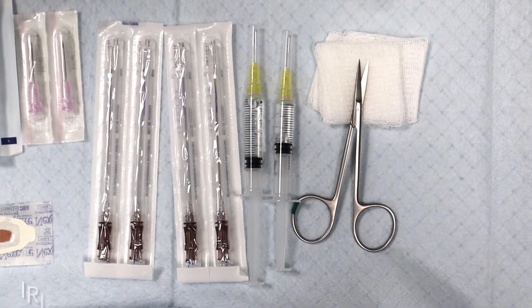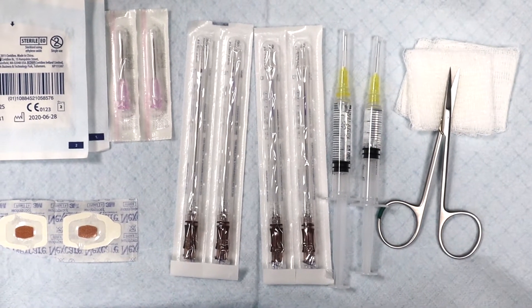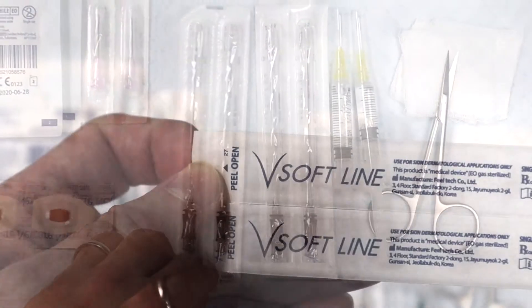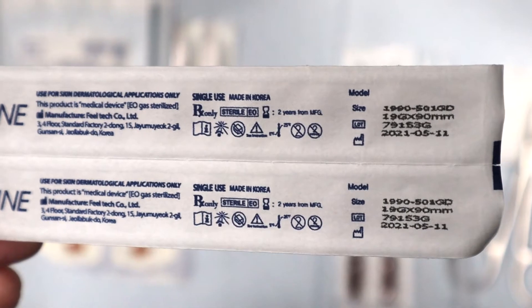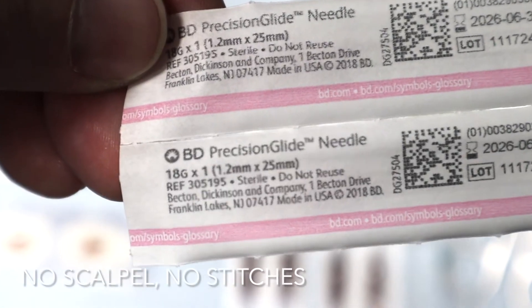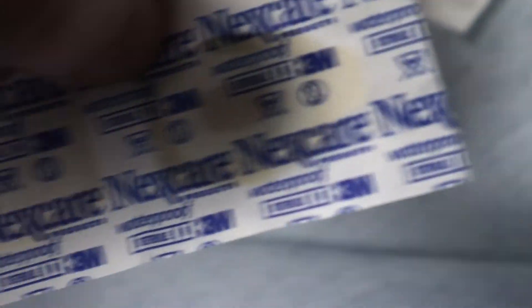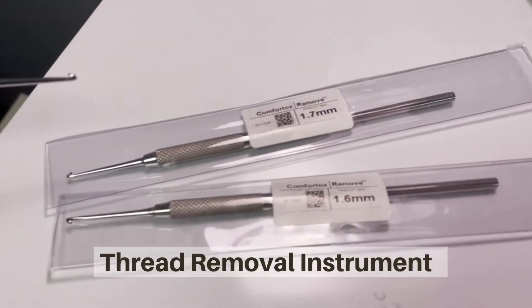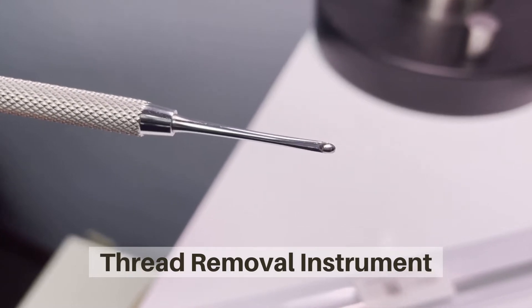This is the tray setup we use: very sharp and sterilized iris scissors, 2% lidocaine with epinephrine in 3cc syringes with 30-gauge needles. Those are the threads in the middle with the long cannula — they're V-Soft Line, 90 millimeters long. You need a couple of sterile 2x2s. I use a 1-inch 18-gauge needle to make the incision point — no scalpel required, no stitches. I also like to use these Nexcare bandaids that are waterproof and clear, and a removal tool made by ComfortTex in case you need to remove a thread.